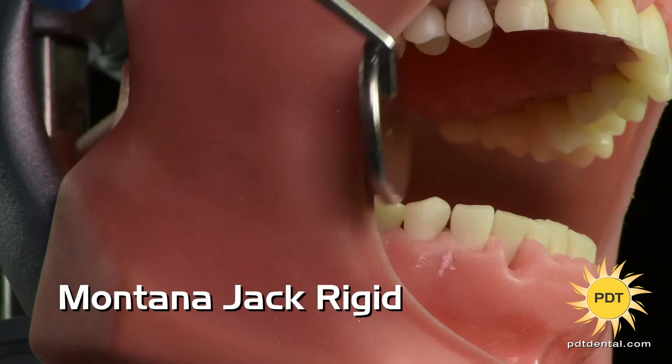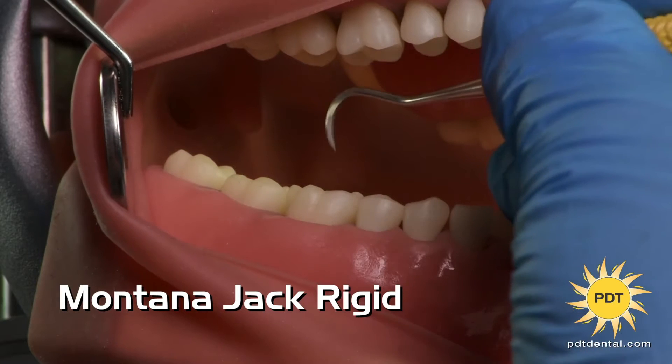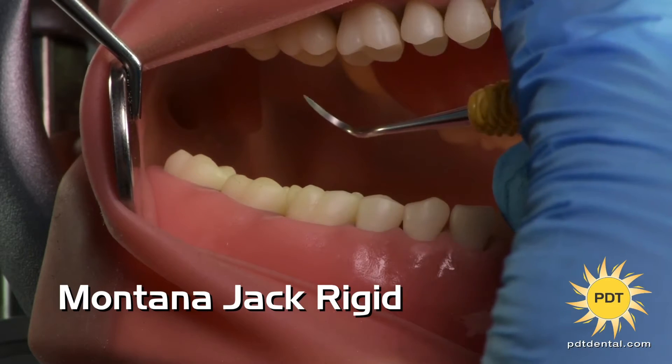Hi, I'm Wendy Bertels, RDH, and this is PDT's Montana Jack Rigid.